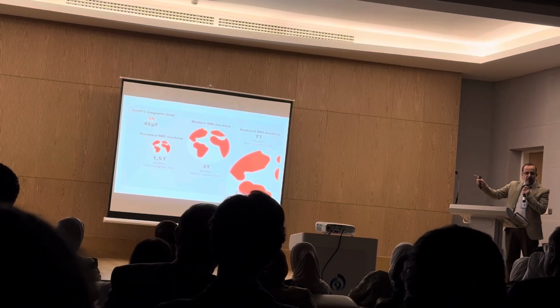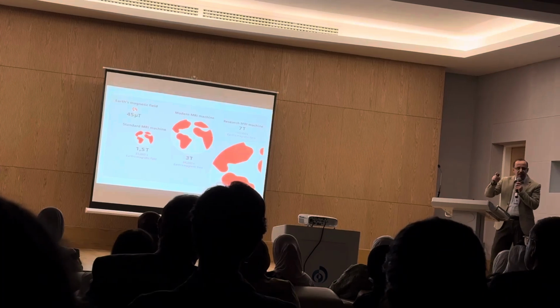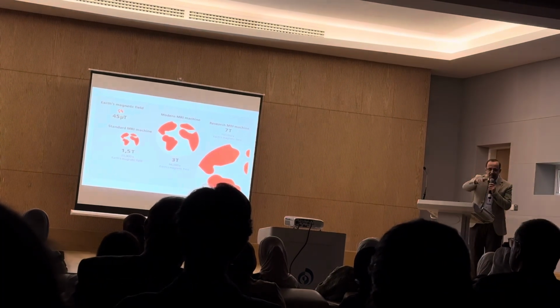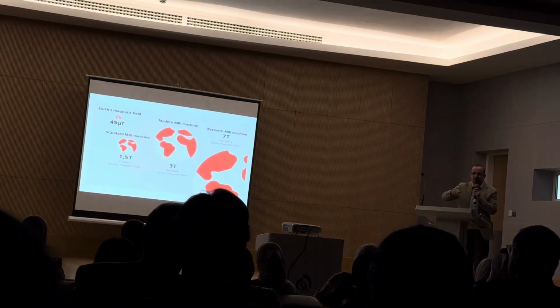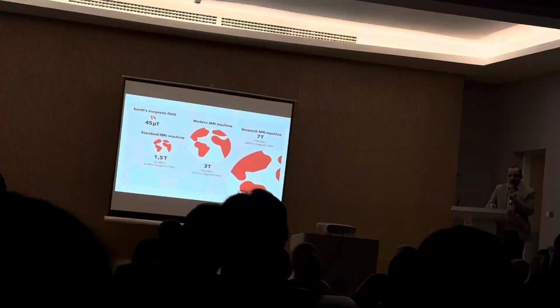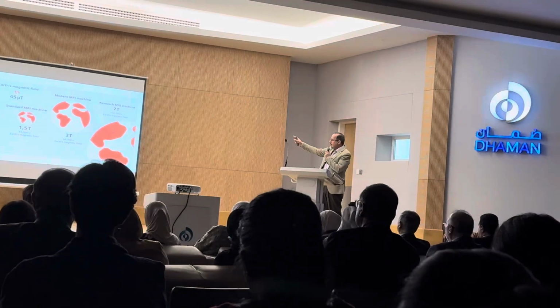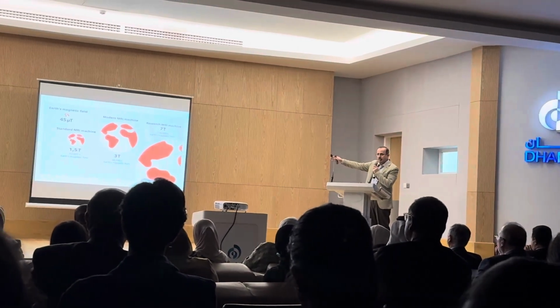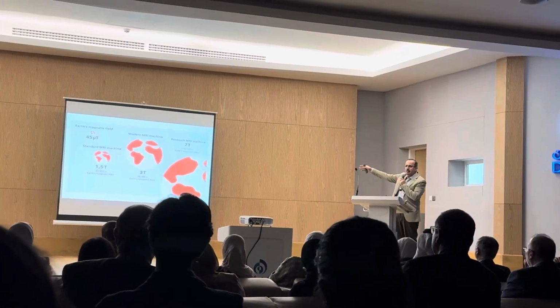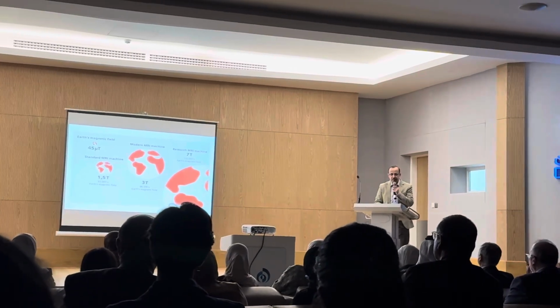Imagine how we are dealing with such a high-strength magnet in a closed area where the patient can't move, the staff are available, and a lot of equipment is present. And of course, if we are talking about a 3 Tesla, it will double, and if we go outside the diagnostic range, we will have an amazing, markedly strong magnetic field.